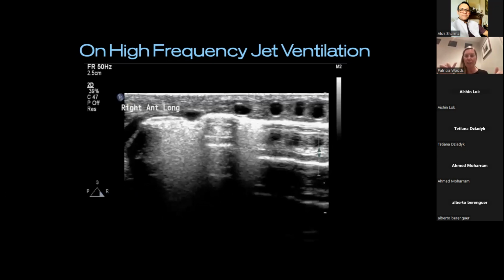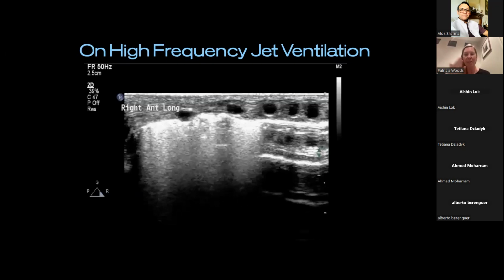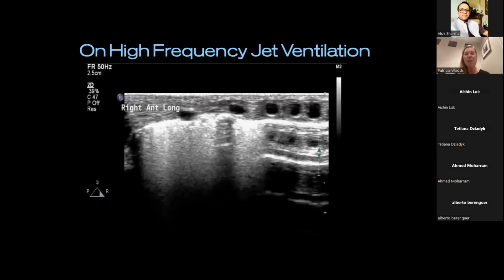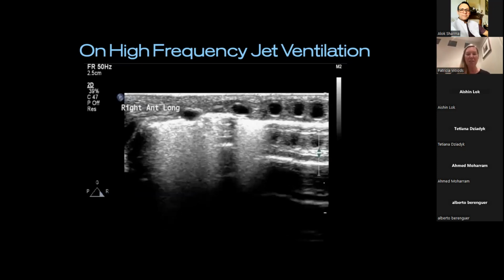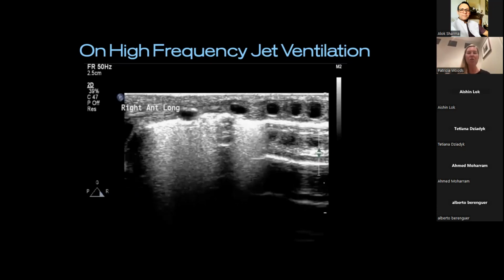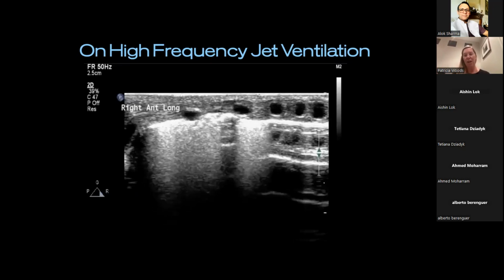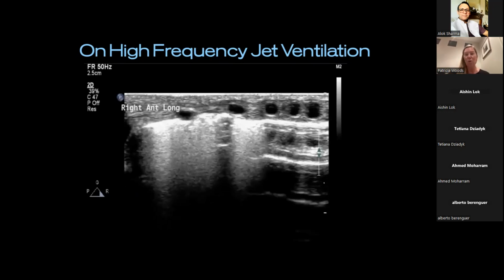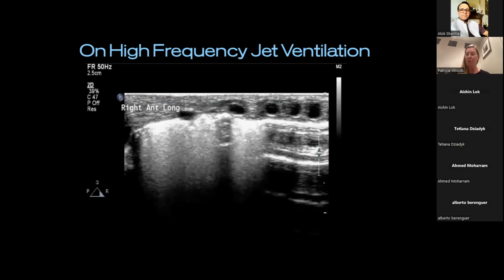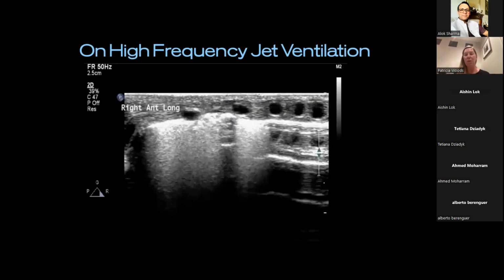So observing tiny little one. This is right anterior longitudinal, so mid-clavicular line. You can see the little ribs in cross section. Note the change of the quality of the pleural line here. Okay, superior region, you've got fuzzy, coarse, bright, irregular, huge dominance of B-line coalescence. And as you come down inferiorly in that chest, further down the sternum, you start to hopefully observe a change in that quality of pleural line, maybe mirror image artifact, stronger A-line profile, and absence of B lines. And that transition right there, you should be observing, is lung point.